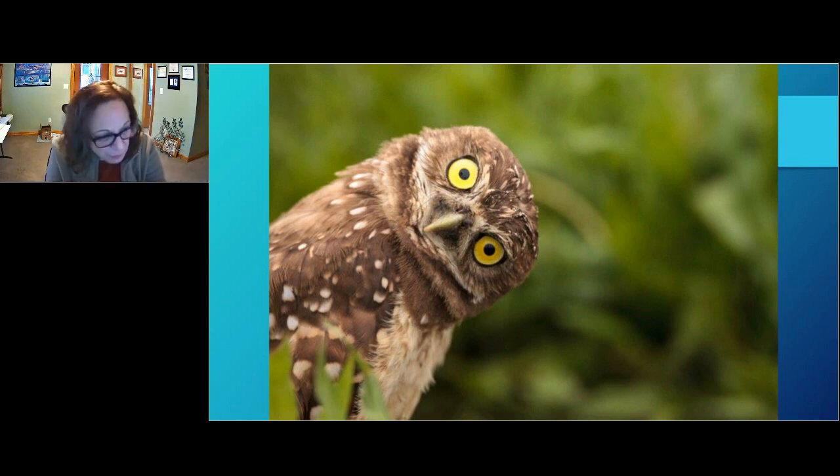You can look at instrument transport. That's a good place to start, okay? Is that safe? Does it meet OSHA requirements? The OSHA bloodborne pathogen standard doesn't cost anything. You can go to OSHA, you can Google OSHA bloodborne pathogen standard, and it'll come up. You can download it. You can read it. You can actually search it electronically for instrument handling. I'm trying to think of the exact verbiage, but I know instrument transport's in there. And then you can read to them what it should look like in case you get resistance. Okay, that's one good place to start.